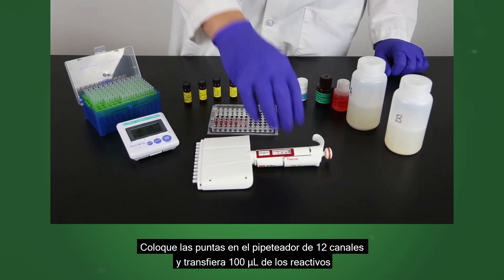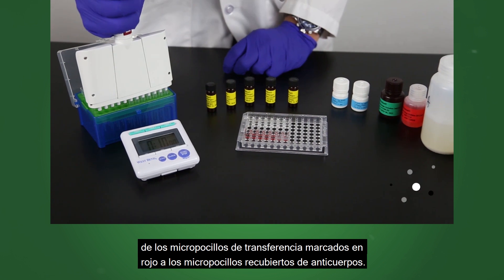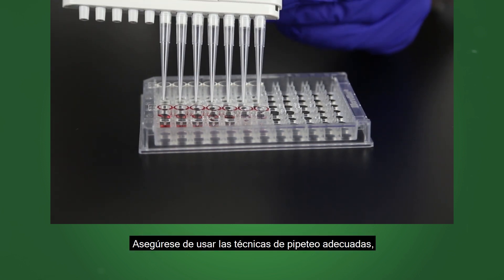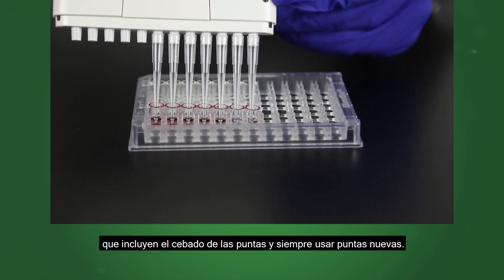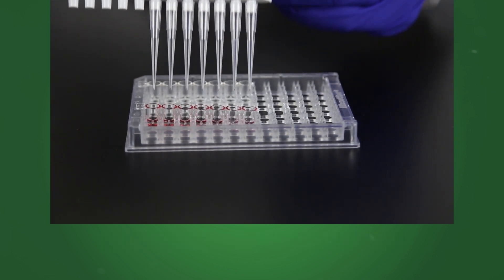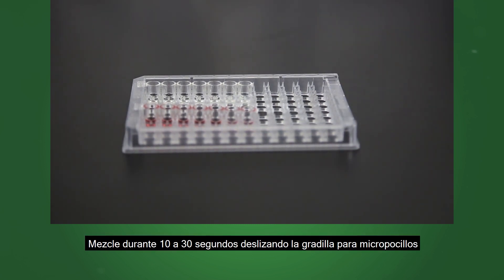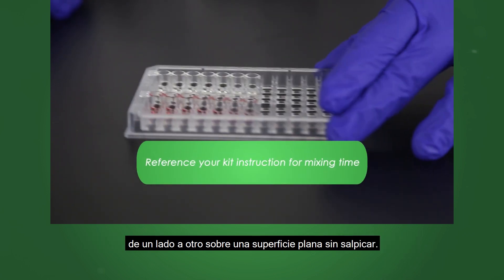Place tips on the 12 channel pipetter and transfer 100 microliters of the reagents from the red marked transfer wells to the antibody coated wells. Be sure to use proper pipetting techniques, including priming the tips and always using new tips. Mix for 10 to 30 seconds by sliding the microwell holder back and forth on a flat surface without splashing.